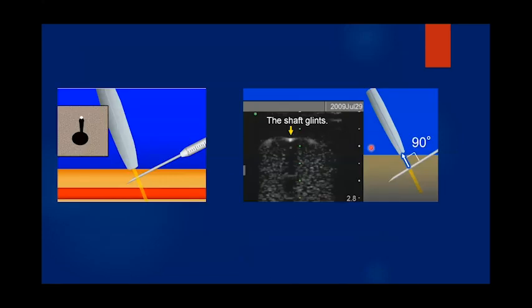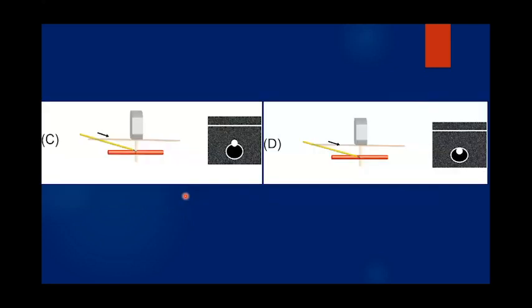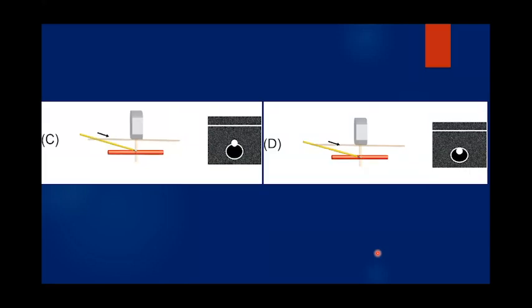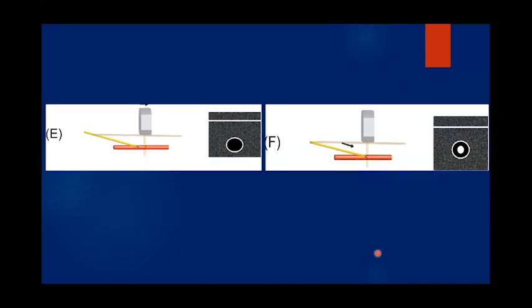So this is what I'm trying to say, that if you have the ultrasound machine here imaging the needle, and they intersect here, you will find something that looks like the tip, but it is not. So what you have to do is use the dynamic needle tip positioning by moving the ultrasound far away from the needle until you completely do not see any needle, and then move your needle in until it shows back again. And you perform this several times: needle in, ultrasound away, needle in, ultrasound away, and you follow your needle in. And that's the dynamic needle tip approach.